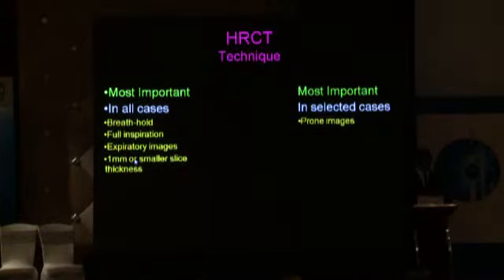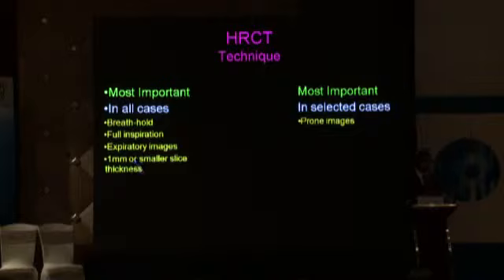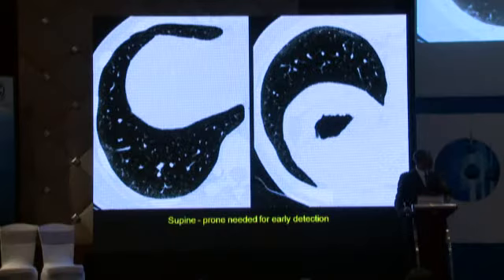By definition, an HRCT image is 1 millimeter or thinner. Every CT scanner manufactured in the last 10 years would allow us to do that, and we need to use high-resolution algorithms, which are very standard. So as I said, none of this is really scanner-dependent. What we need is patient training, and that's what then gives us the quality of images required to make accurate diagnoses.